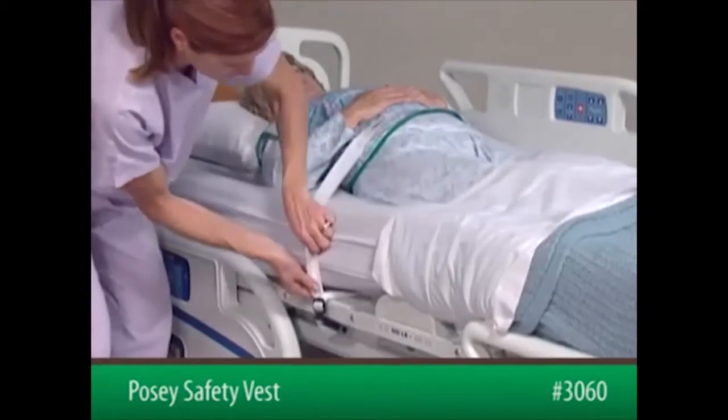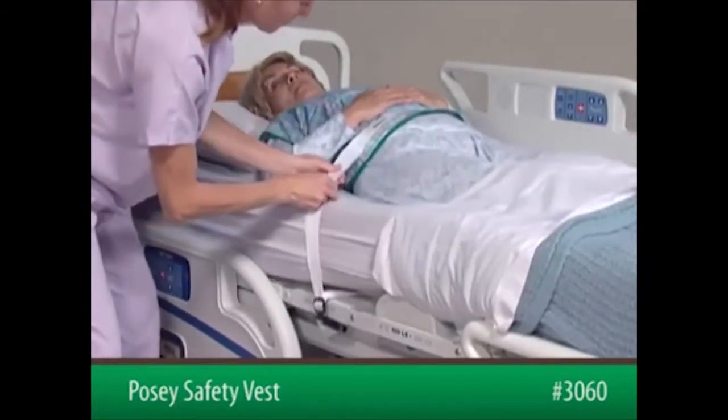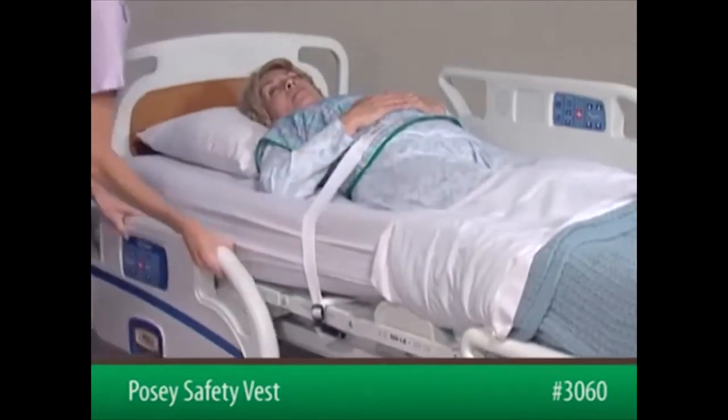Check that the straps are secure and will not change position, loosen, or tighten if the patient pulls on them or if the bed is adjusted.